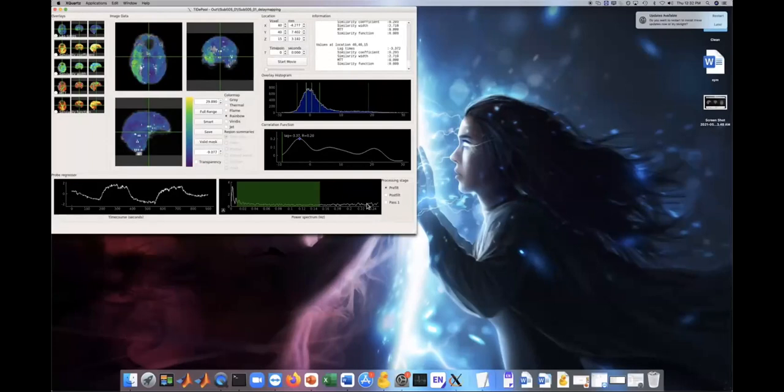Right side is left and left is right. You see this huge area on the right where blood flow is very delayed. That's the green and yellow. In addition, if you look at the lag distribution on the right, you see a rather wide distribution instead of a peaky one, and slightly skewed on the right towards longer delays. So there's a wide range of lags here, and they're longer than usual.